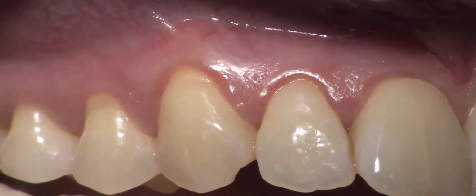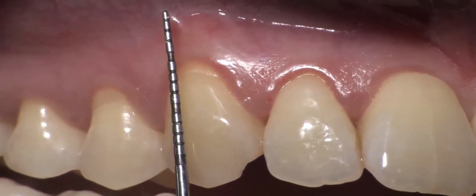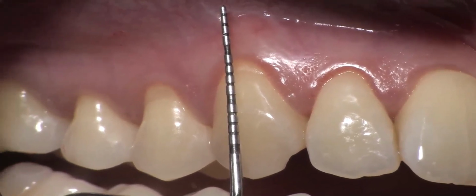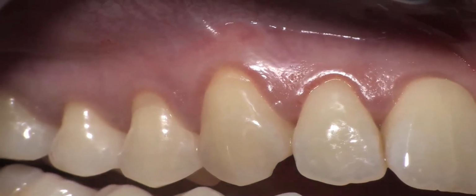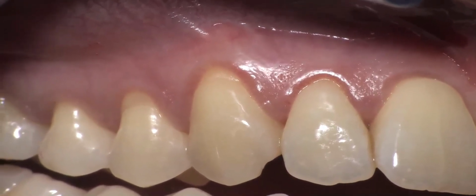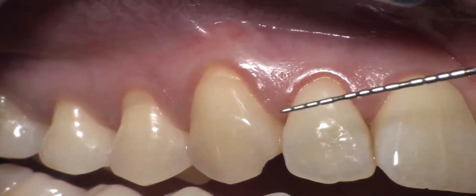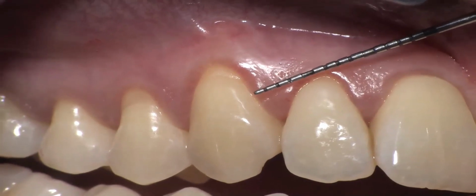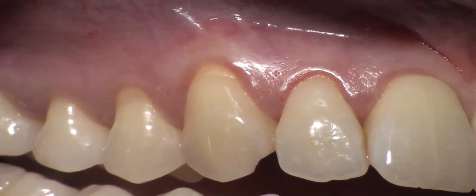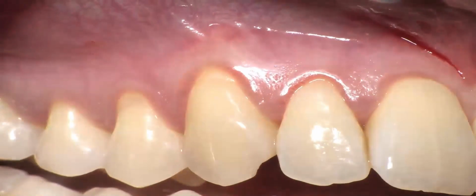When we are treating multiple gingival recessions, all incisions must be directed towards the midline passing through the mid-buccal surface of the canine. Namely, we will start from the gingival recession and make an oblique incision directed towards the canine for the teeth with gingival recessions.